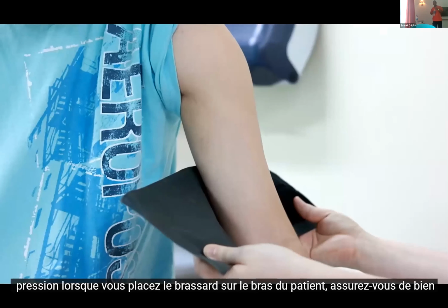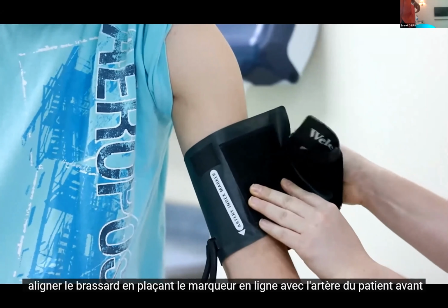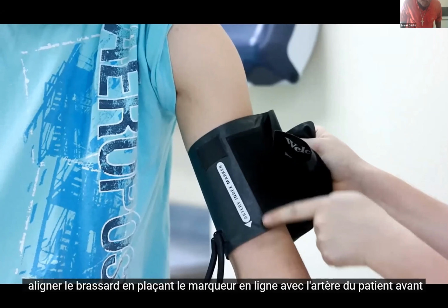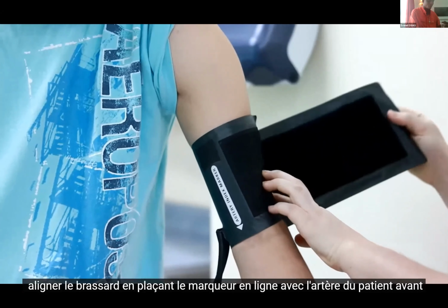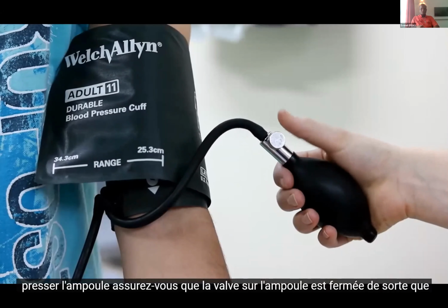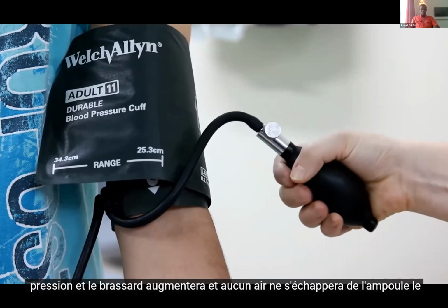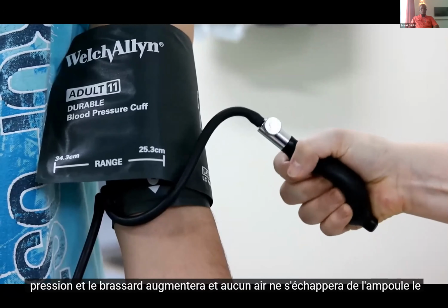When placing the cuff on the patient's arm, make sure to properly align the cuff by placing the marker in line with the patient's artery. Before squeezing the bulb, make sure that the valve on the bulb is closed so that pressure in the cuff will increase and no air will escape from the bulb.